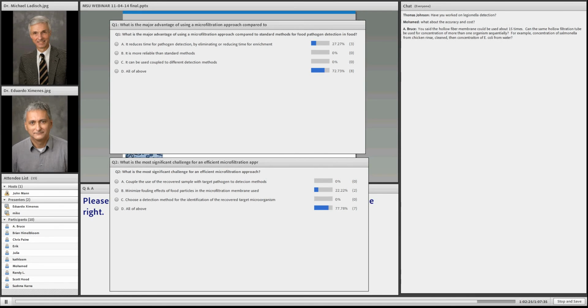meat. And so the main thing is, the next step is to demonstrate this instrument in a way that we can begin to validate, let's say through AOAC, its operation. And it basically, again, perhaps pertains to Muhammad's question on what about accuracy, to show that if we have this instrument working properly, we're able to minimize the number of false negatives, certainly, and hopefully false positives.